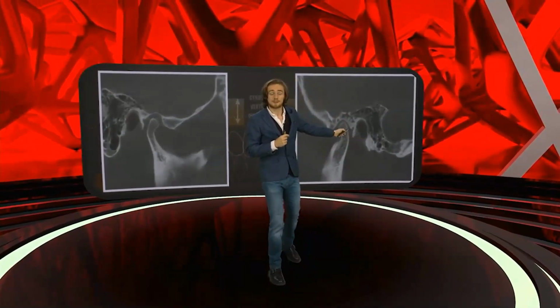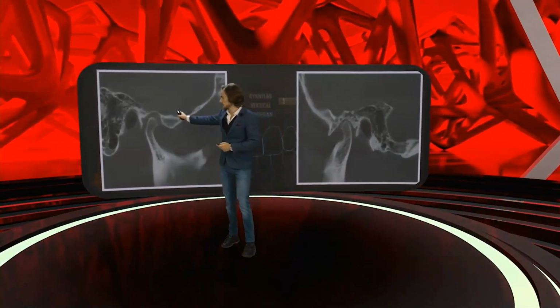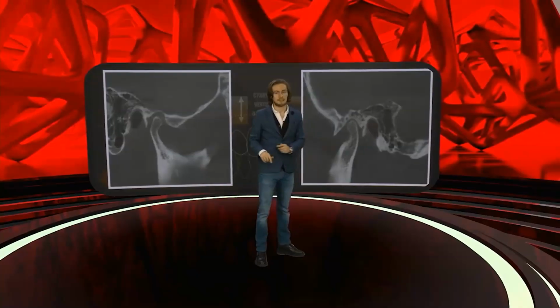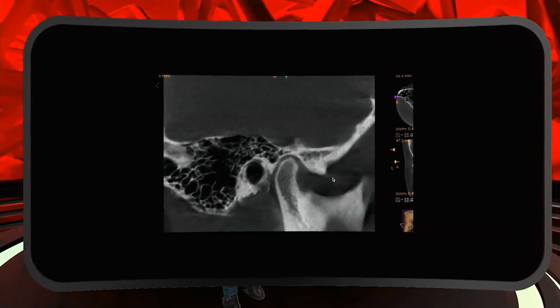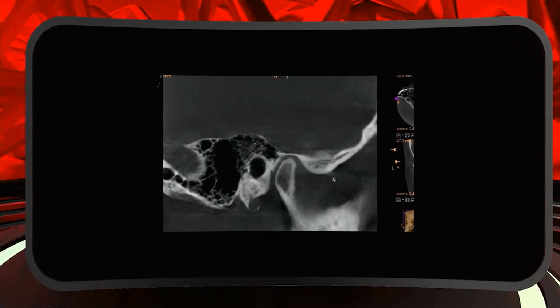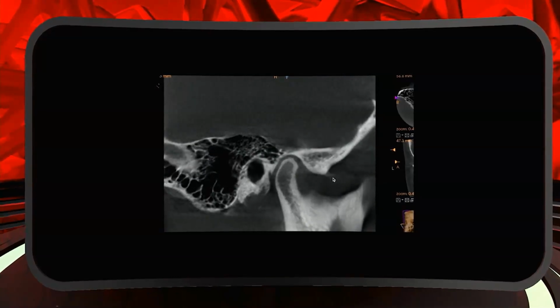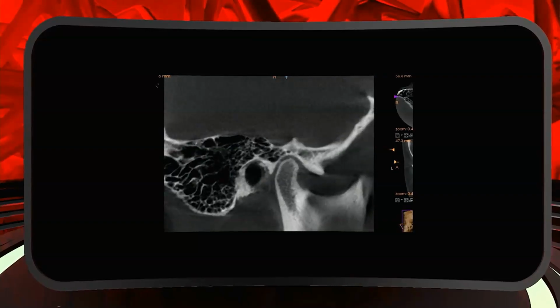Of course, this one. In here, maybe this is too big a distraction. Maybe the condyle is too far from the fossa. But honestly, I do not think so. But in here, there is too big a compression. So take a look at this video. What do we see in here? If we move from the medial pole to the lateral pole, we see that the space remains very narrow. And we can also measure it.